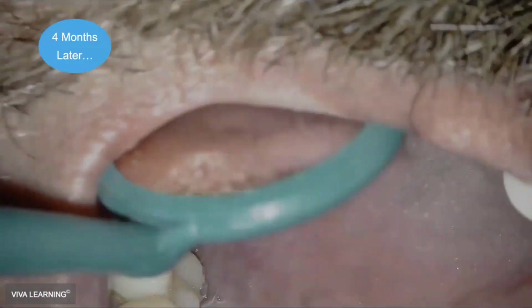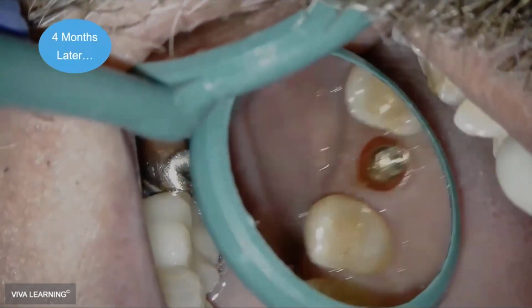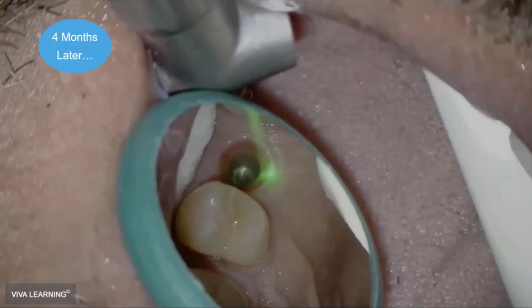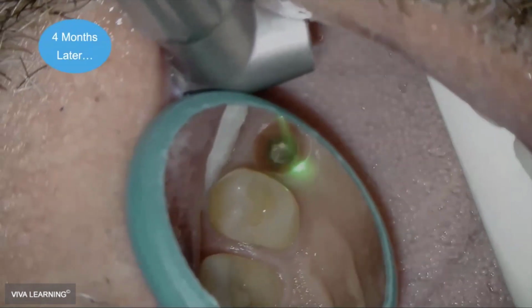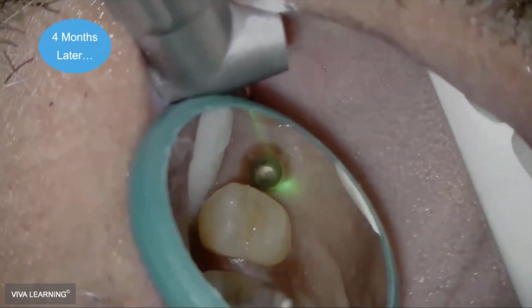So here we've got the healing abutment that we took out. It's a stock healer, of course. We're looking at all the keratinized tissue, but it's circular and kind of narrow. We want it to be a little bit wider. And so what we're going to do with our laser is gently increase the diameter, let's call it a millimeter around the whole implant. So if you add a millimeter on both the buccal and the lingual, that's increasing the diameter of the circle 2 millimeters total. And it just makes for a more gentle, subtle emergence profile.